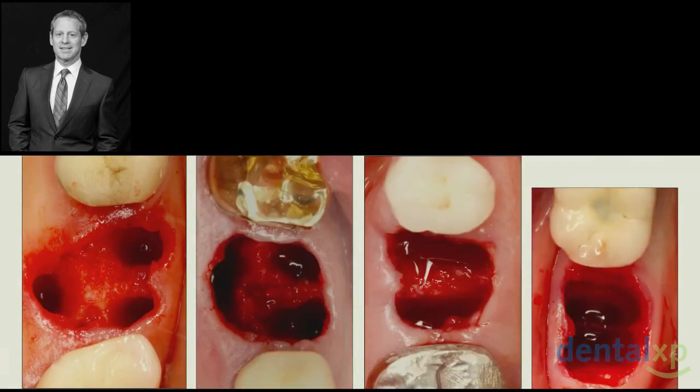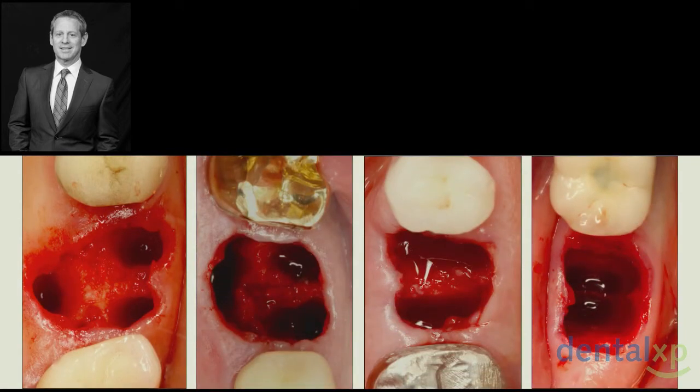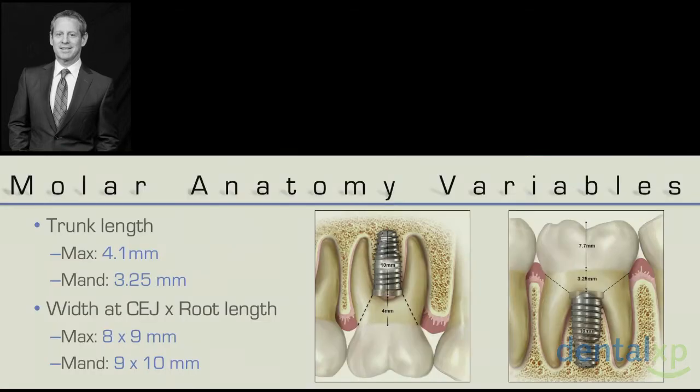And this is what they look like clinically. There's your type A, a couple of type Bs, maxillary and mandibular, and of course the type C. And the type C sockets mostly occur in the second molars, both maxillary and mandibular. That's where we find most of our conical-shaped molars. Right? The first molars in general are either the mandibular, the two-rooted teeth, or the three-rooted typical molars. So the type Cs mostly occur, not completely, not all the time, but mostly occur in second molars.